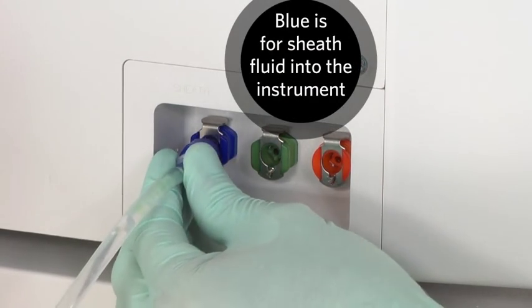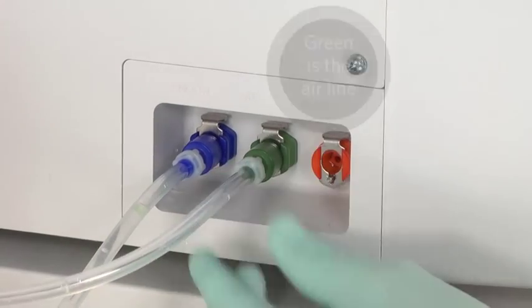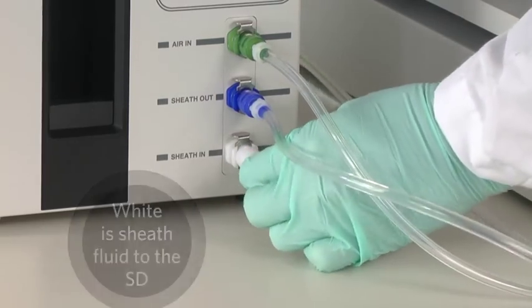The connectors are color-coded to make it easy for you to connect them properly. Blue is for sheath fluid going into the instrument. Green is for the air line that creates pressure. Orange is for the waste fluid. White is for sheath fluid going into the Luminex SD.